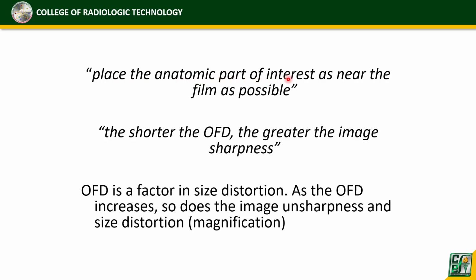Okay? So, yan. Place the anatomic part of interest as near the film as possible. The shorter the OFD, okay, the greater the image sharpness. So, ito na yung relationship. Ito yung dapat natin tandaan. Okay? So, OFD is a factor in size distortion. Okay? As OFD increases, so does the image unsharpness, sabi nga natin may unsharpness, and may magnification, size distortion. Okay? Question, OFD, naintindihan po ba?